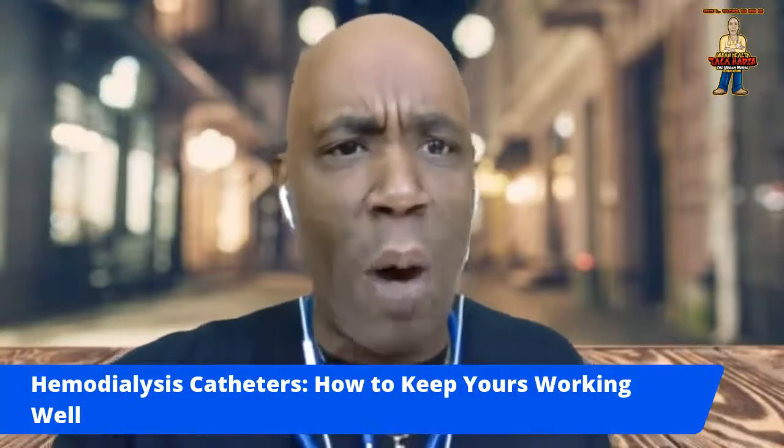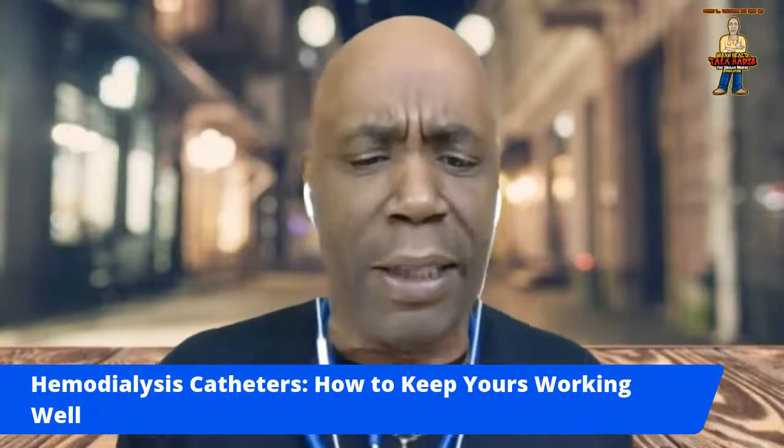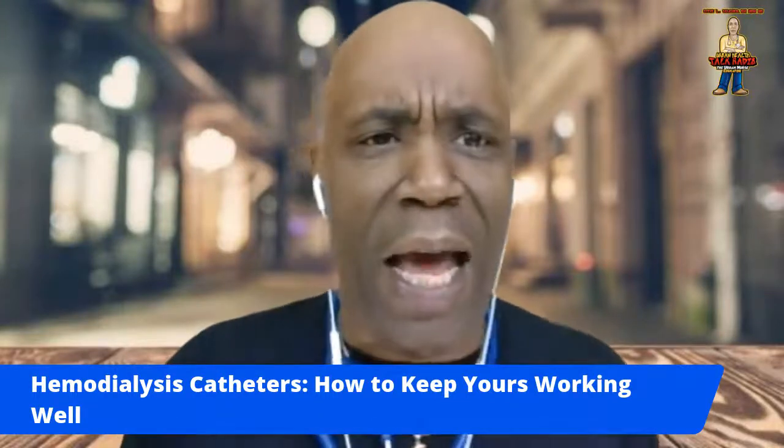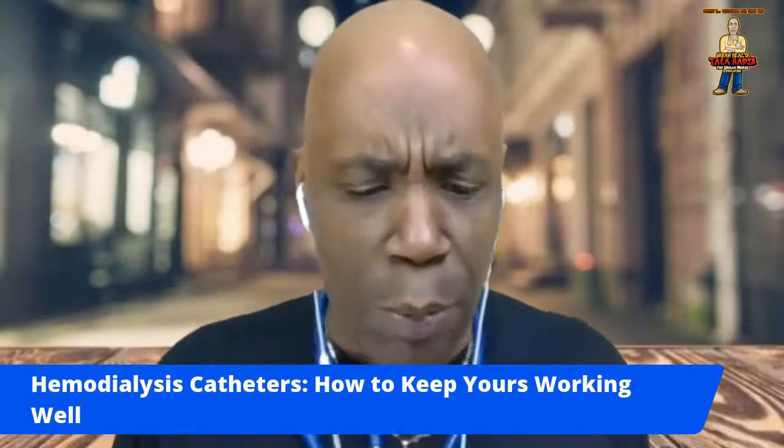What can you do to keep your catheter working well? Learn as much as possible about your prescribed treatment plan. We always encourage that on our shows. Know your blood flow rate, how often and how long you need treatments. We always talk about checking your treatment orders, how long you run, what your blood flow rate is, what it should be, and if they're turning it down, why they're reducing your blood flow rate. Because if your blood flow rate is being reduced, you're not getting a good treatment, bottom line. And you're going to feel horrible.